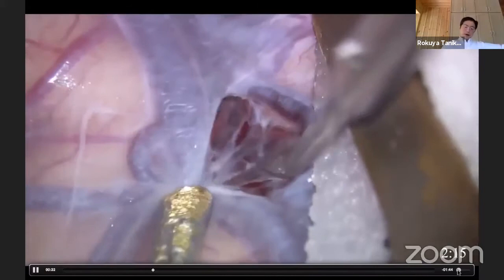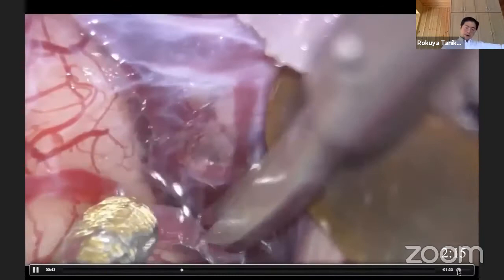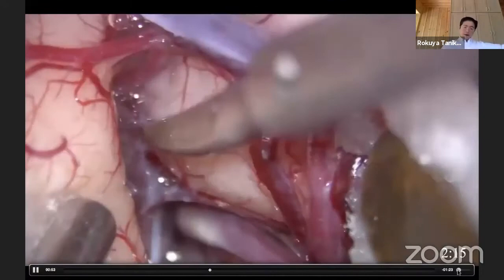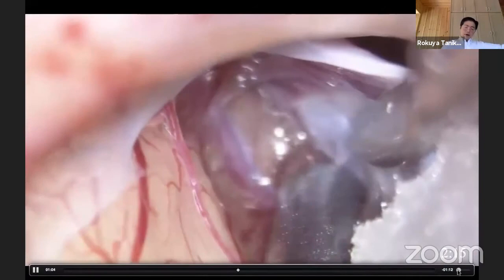I am trying to enter the insular system by separating the superficial sylvian vein and small MCA arteries coming up to the temporal surface. The temporal lobe and the frontal lobe are adherent with tiny arachnoid trabeculae. We can cut only the arachnoid trabeculae — other structures cannot be cut, cannot be sacrificed. With the highest magnification, even tiny veins can be seen and confirmed.